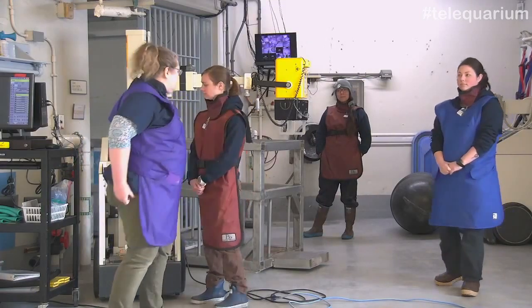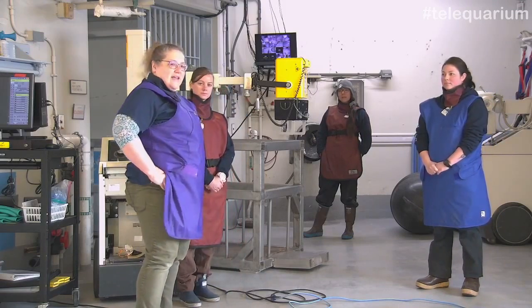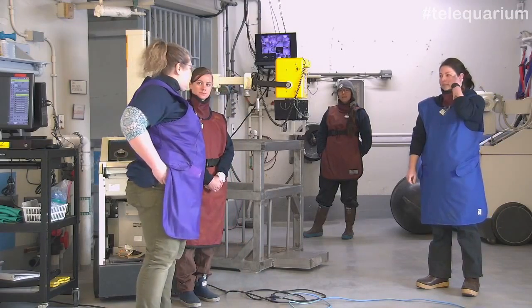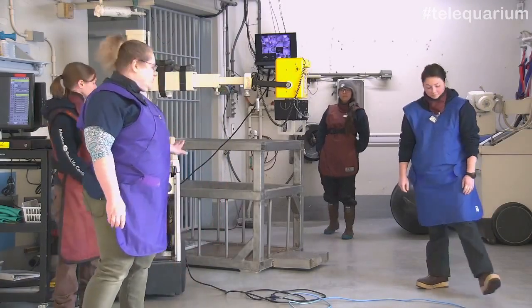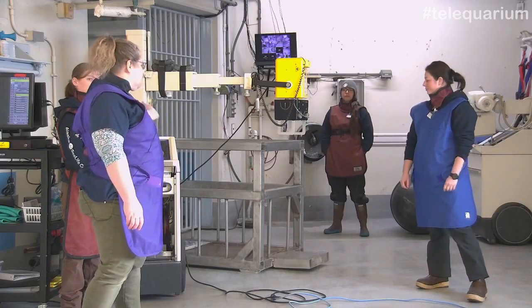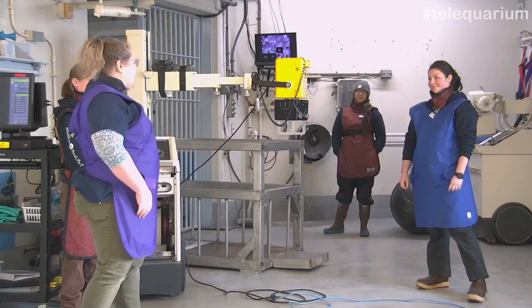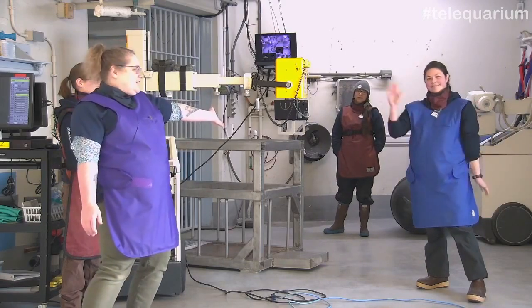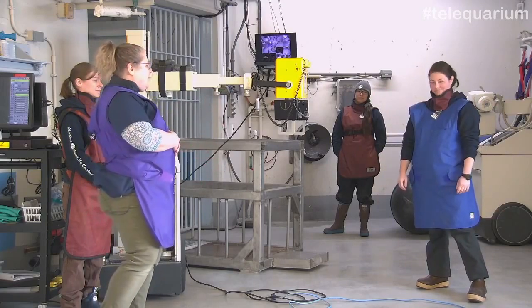Okay. So what we're gonna do is, what's amazing is that Mara has wonderful behaviors, and what she's going to do is, here if you wanna take a step back, she's gonna go into this chute. We have an x-ray plate on the bottom of the chute, and she's gonna gently come in, lay down with amazing care from Shelby. This is Shelby, she's one of our mammalogists, and is Mara's primary for this particular behavior today.